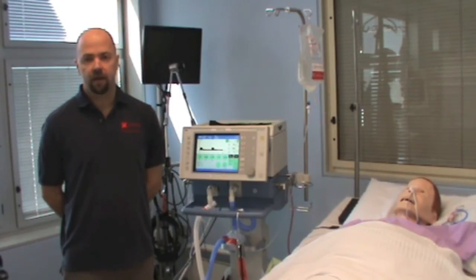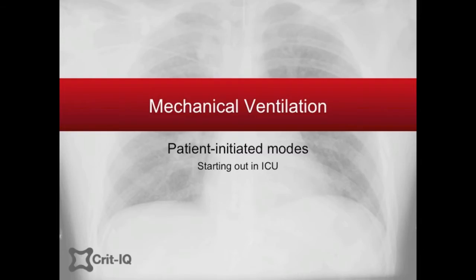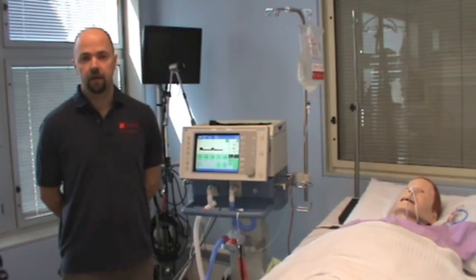However, as the patient wakes and effort to breathe returns, these efforts may be unrewarded by the ventilator. This can be very distressing. For this reason, modern ventilators have the ability to recognise when a patient attempts to breathe and to support that effort. In this podcast, we will review these modes of ventilation, including assist control, intermittent mandatory ventilation, and pressure support ventilation.